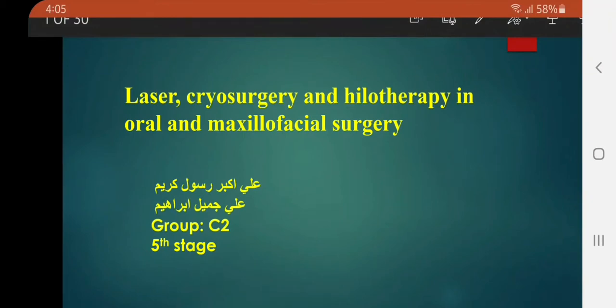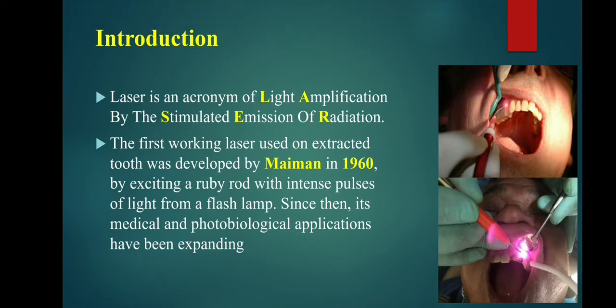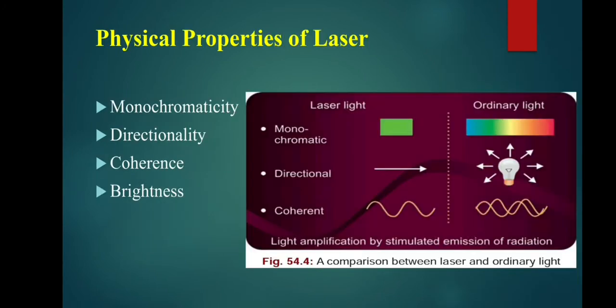Laser, cryosurgery, and hilotherapy in oral and maxillofacial surgery. Laser is an acronym of light amplification by stimulated emission of radiation. The first working laser, used on extracted teeth, was developed by Maiman in 1960 by exciting a ruby rod with intense pulses of light from a flash lamp. Since then, its medical and photobiological applications have been expanding.